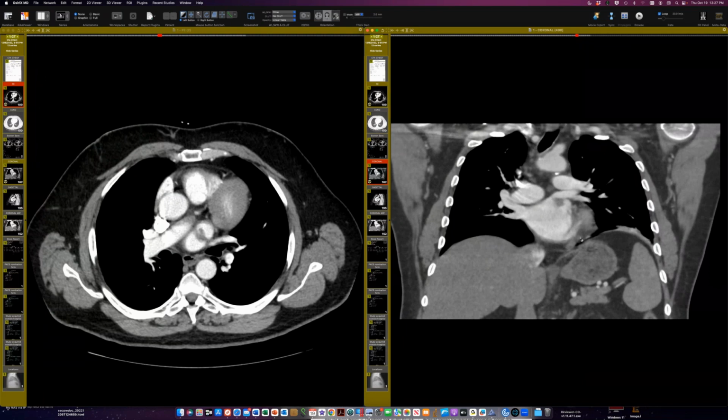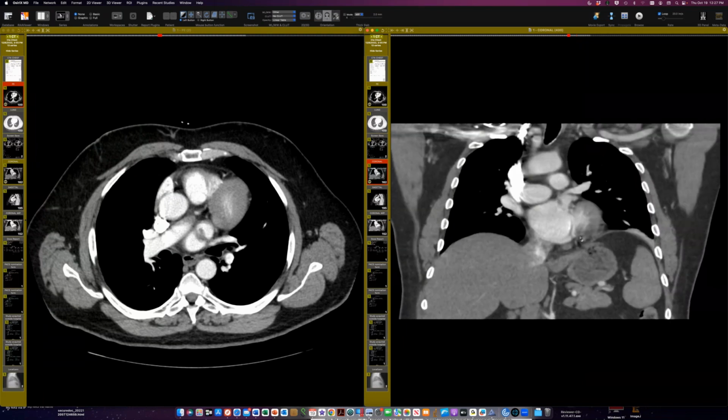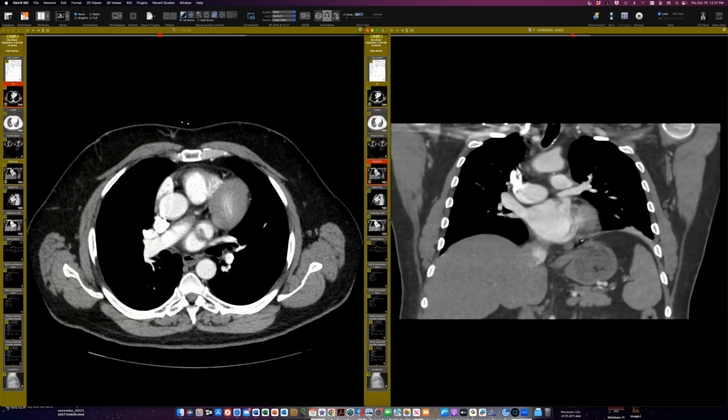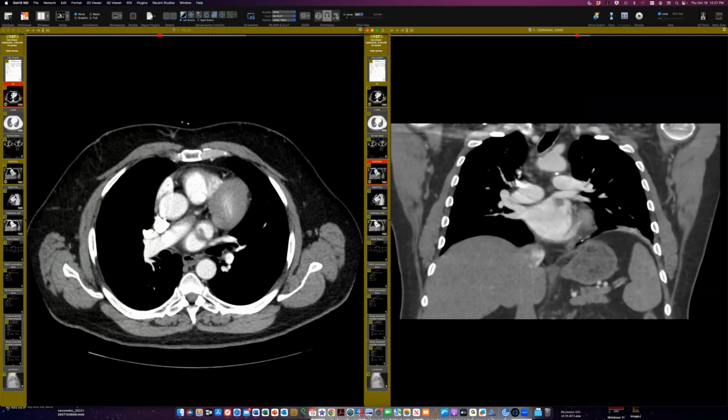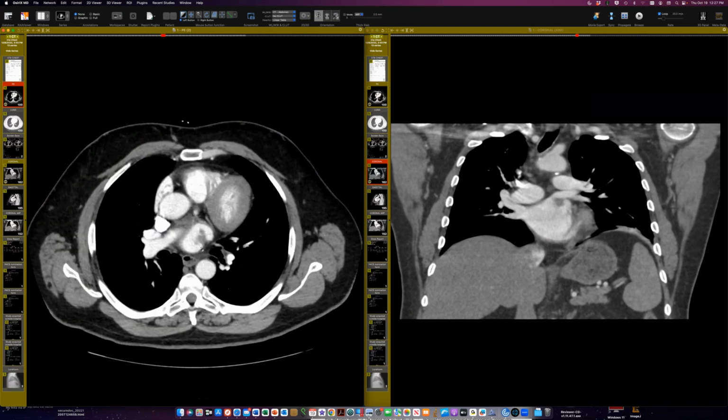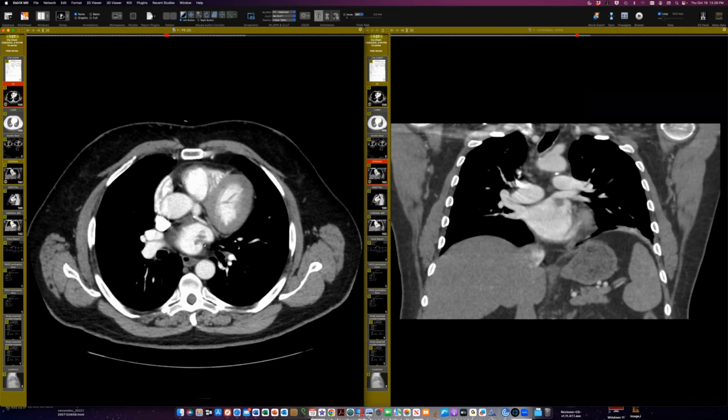It's one of those things where, depending on the patient and the symptomatology, they can always get an MR to confirm it's muscle or clot or something else. That's usually pretty easy to distinguish. So MR might be the way to go. MR will give you the definitive answer, but it's so expensive. I think echo is a fine place to start. It's fair to say it's likely just a band of muscle, but it would be hard to exclude a clot.